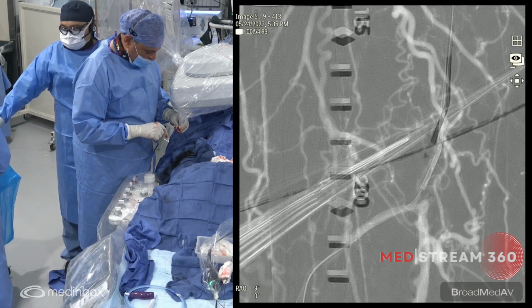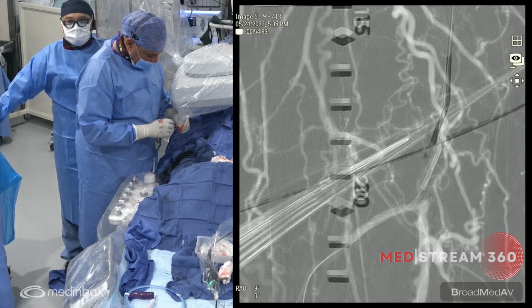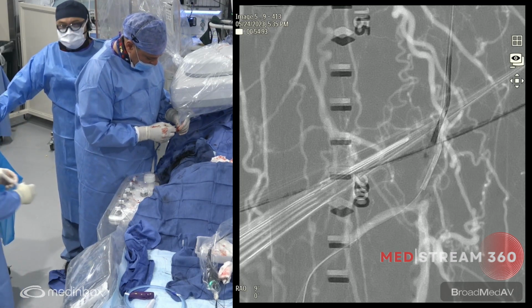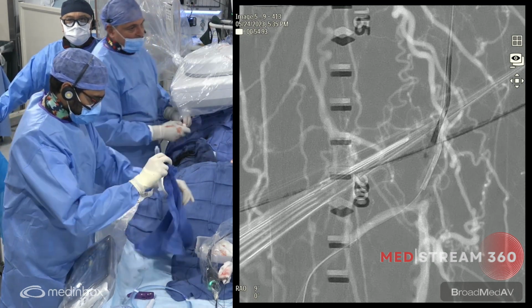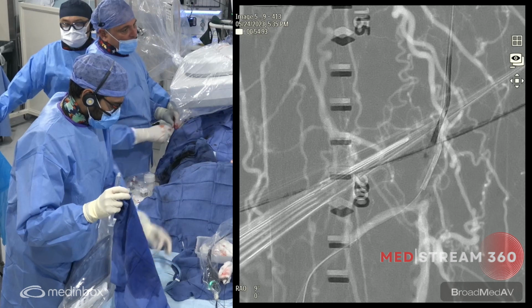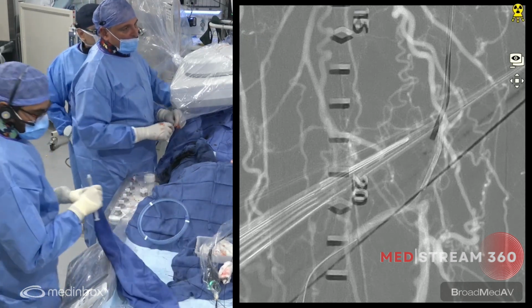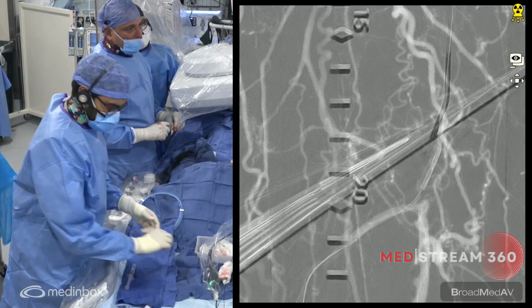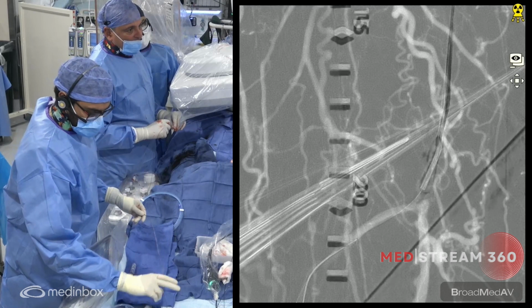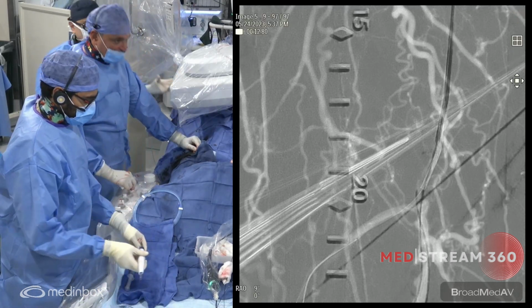So now the problem I'm having is I'm not able to get parallel to the vessel. So I'm going to extend my dissection plane down by using an 035 wire, and then extend my dissection plane a little bit closer to where I need to be able to enter with this device. So what I'm going to do is I'm just going to go ahead. Hopefully this pops in, solves all our problems. So let's see. So now I'm going to go here, and it did. I think it just popped in. So exactly like I thought would happen, happened.